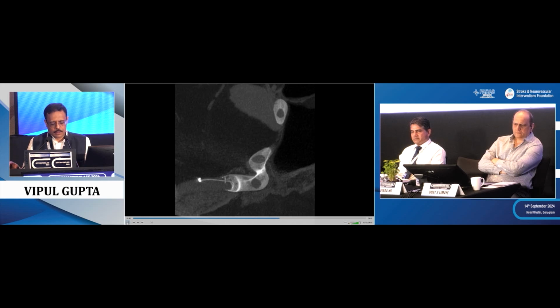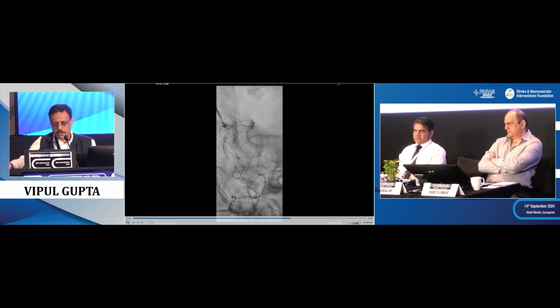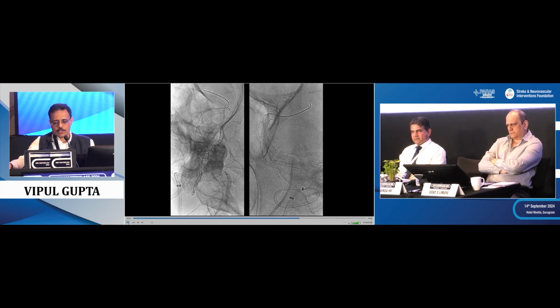And then we did angioplasty in this particular patient. So this is a case of fish mouthing, but delivered by extra force and because of our excessive manipulation. We created two views where we realized that if this angle goes like this, then we are safe. And then over a 17 microcatheter, we were able to cross with a very soft wire.